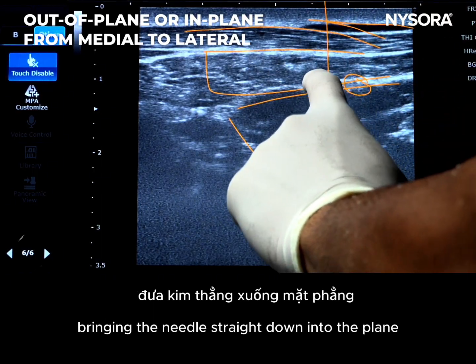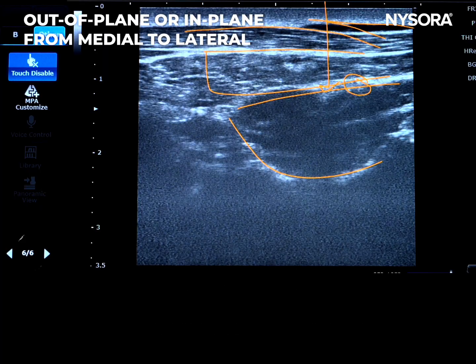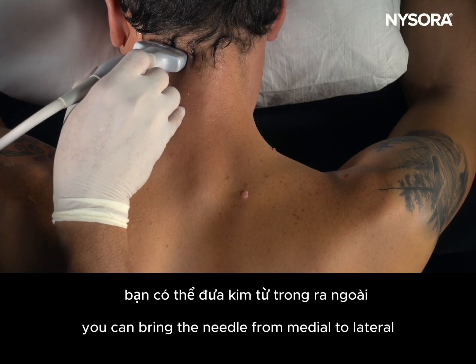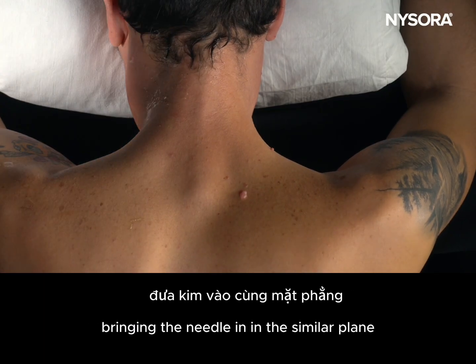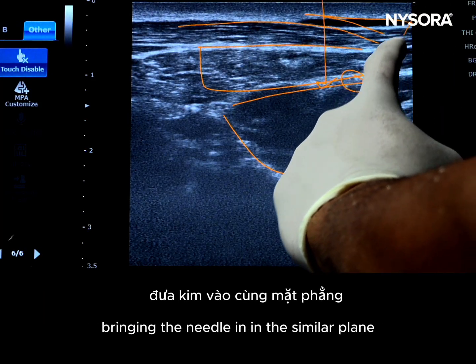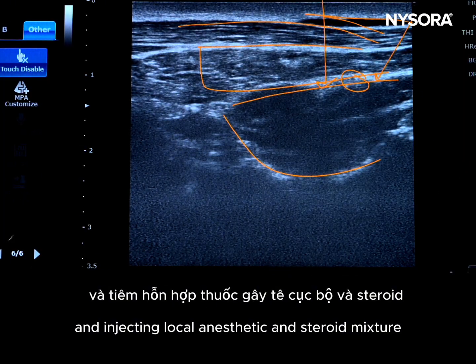To perform the injection, you could perform this with an out-of-plane technique, bringing the needle straight down into the plane between the obliquus capitis inferior and semispinalis capitis. The other way to perform this injection, you can bring the needle from medial to lateral, bringing the needle in a similar plane, in-plane technique, and injecting local anesthetic and steroid mixture.